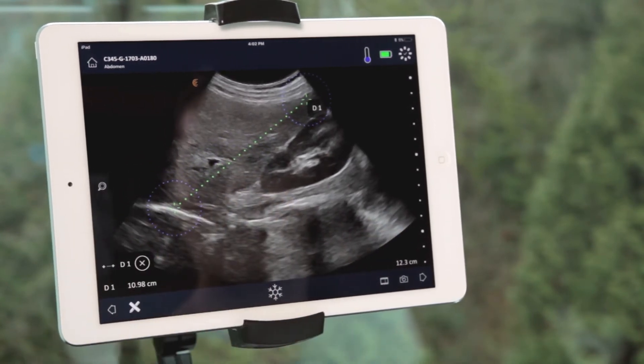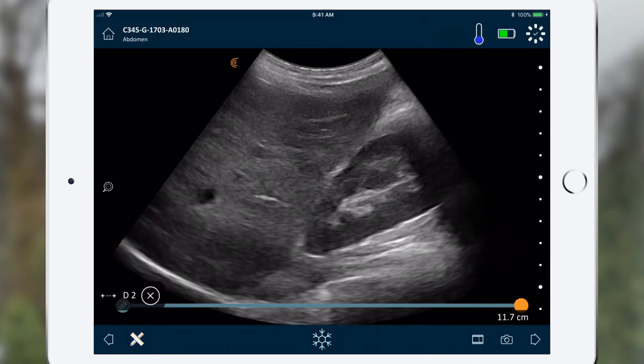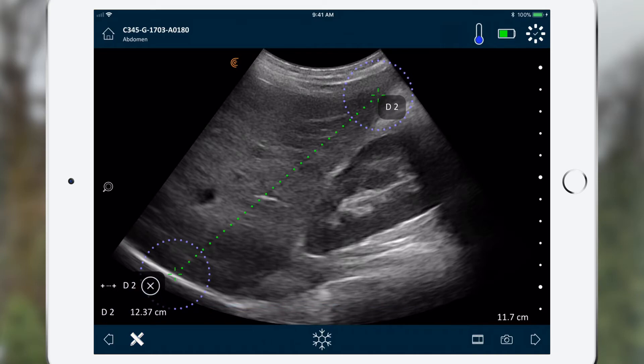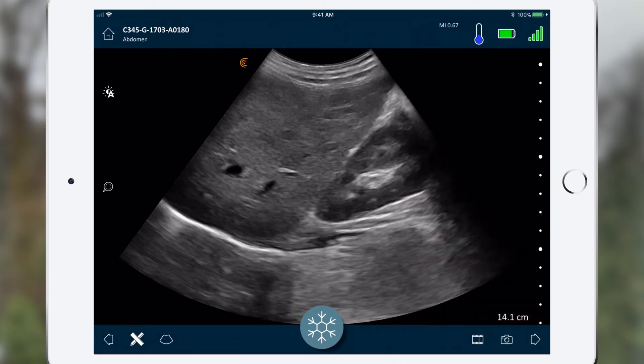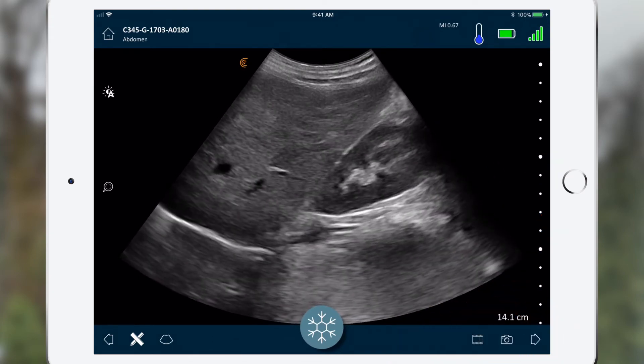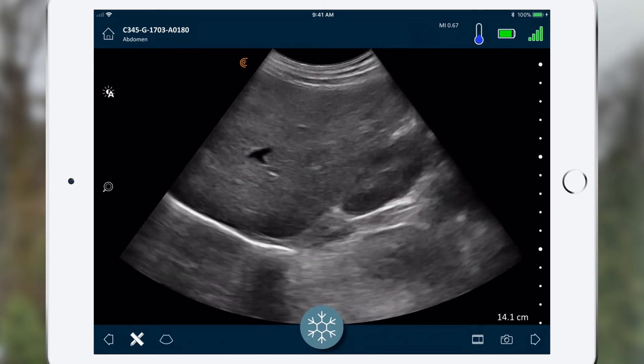A measurement and corresponding image can be saved by pressing the camera icon. A message will confirm the image was saved. To record a video, press the freeze button to enable live scanning. Long press the video icon to select the duration of the clip you wish to save, then tap the video icon again to record. A message will confirm the video was captured.